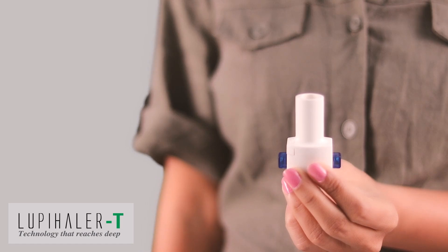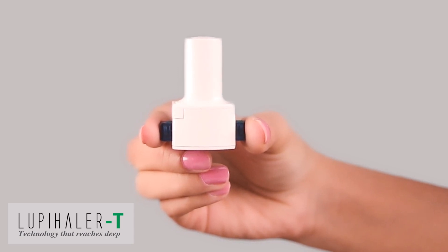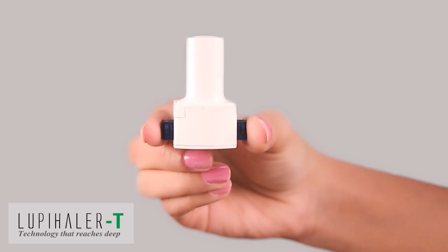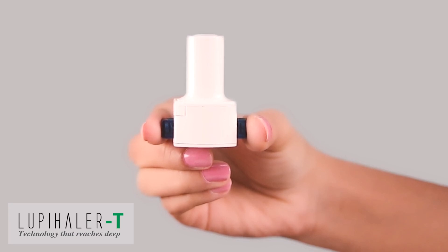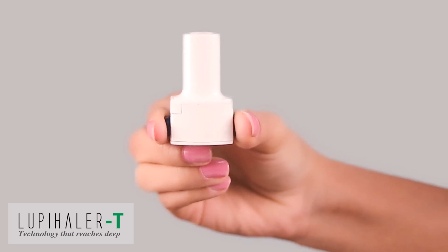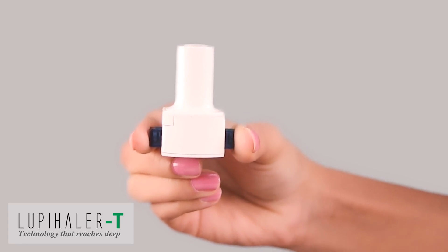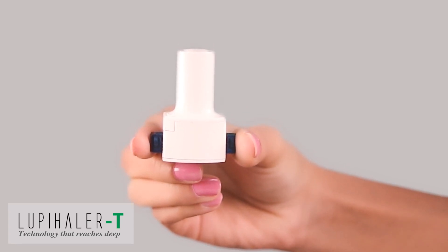Hold the Lupehaler T in an upright position and place the blue button between your thumb and forefinger. Press both blue buttons simultaneously while applying fast and tight pressure. This causes a hole in the capsule located inside the capsule chamber. You are now ready to use the Lupehaler T.